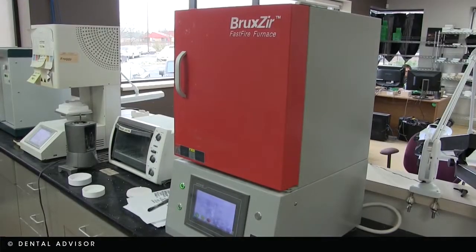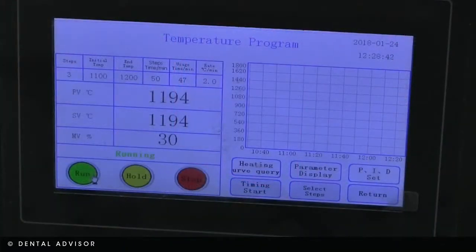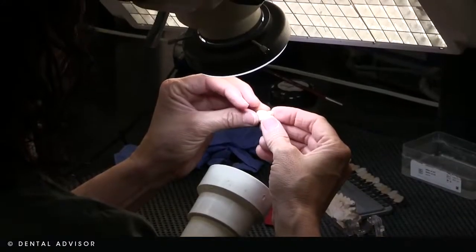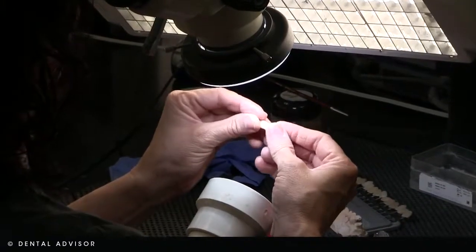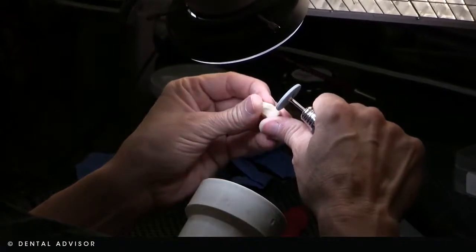After the unit has had its sprue removed, it goes into our sintering furnaces where it's sintered. The temperature and time varies with whatever material we're using. Once it comes out of the sintering furnace, it is identified back to its original bin and given to one of our techs, who takes it under a microscope and assesses the unit for any type of fracture.